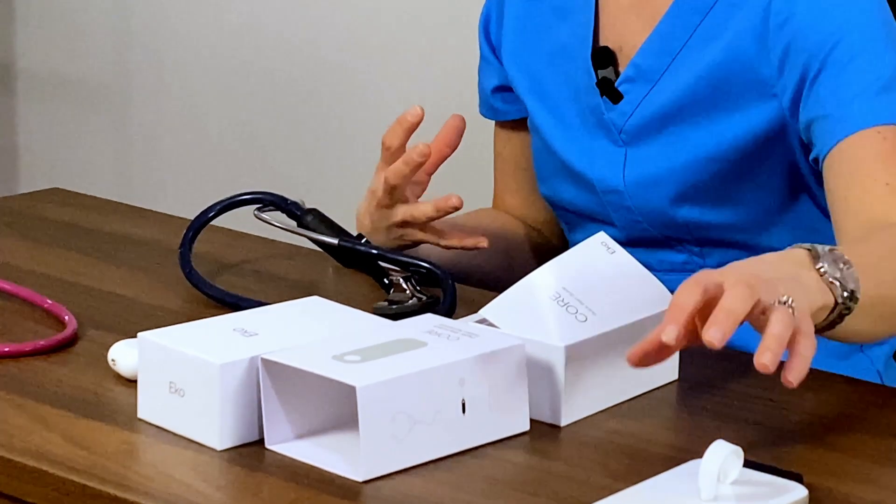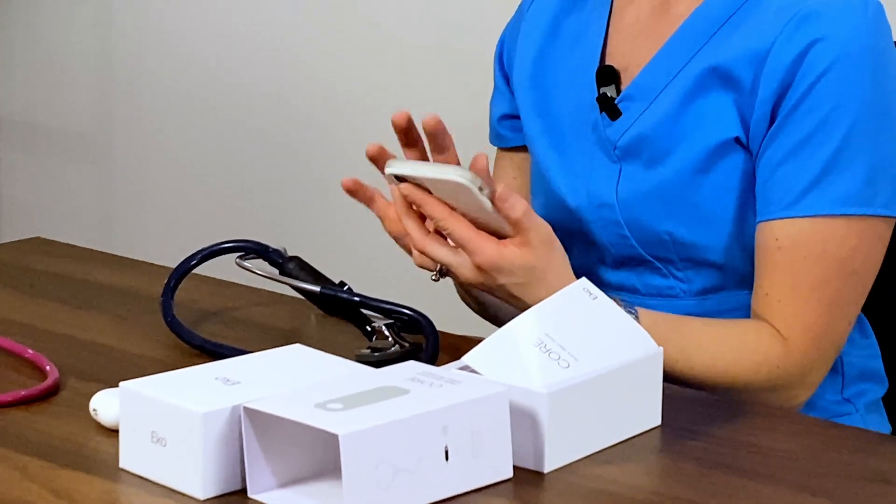I decided to do what most nurses do and check this out on myself first, because I'm honestly very curious to hear what this Eko Core digital attachment really sounds like with this amplification. So I'm going to utilize myself first, open up the Eko app, connect my device, and turn the attachment back on. Let's go ahead and see what this is about.